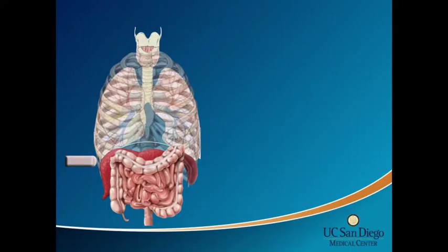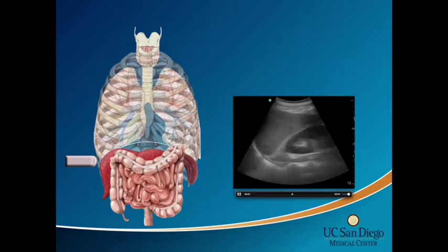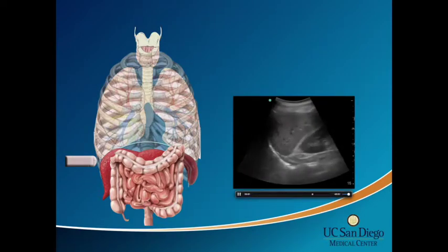The next view we commonly do is the right upper quadrant view, and here's what it normally looks like. So you can see the liver here, using your acoustic window. You have a kidney here, which is retroperitoneal and really not shown here, and this bright line right there, that's your diaphragm. And down here, because we're shooting from the right side going to the left side, going deeper.